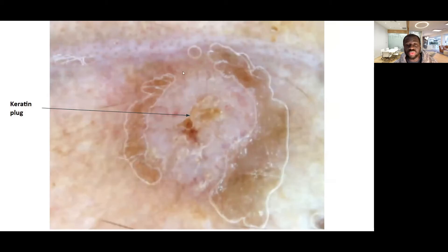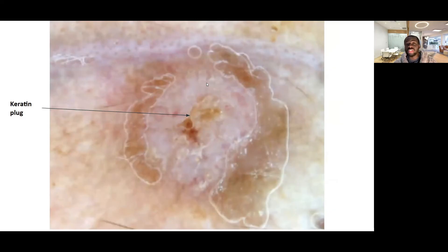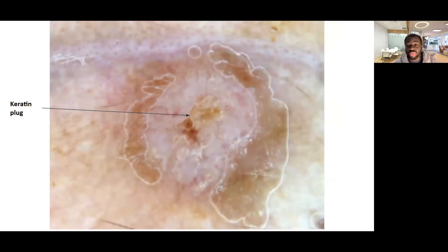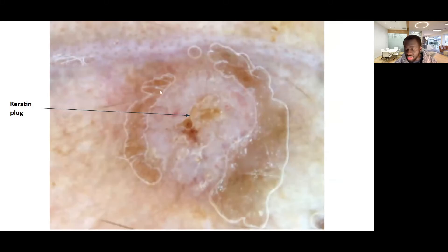These structureless white areas are due to how invasive cell carcinoma behaves — as we discussed, white structureless areas usually connote destruction of normal tissues by the cancer cells, and replacement of those normal tissues with fibrous tissue and fibrosis. Squamous cell carcinoma is also a malignancy, so you could have those white structureless areas, but usually there is also keratin within those areas.